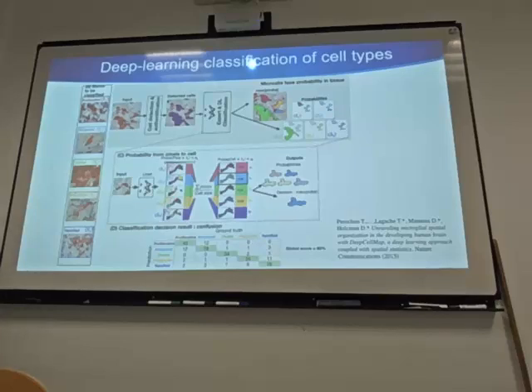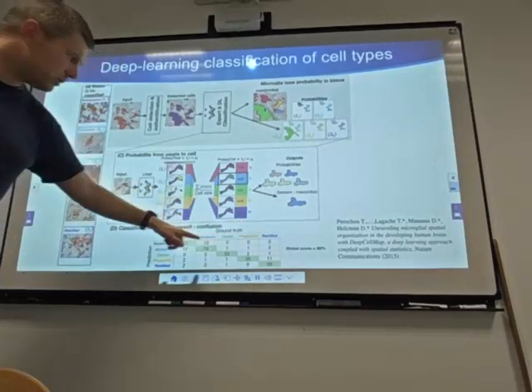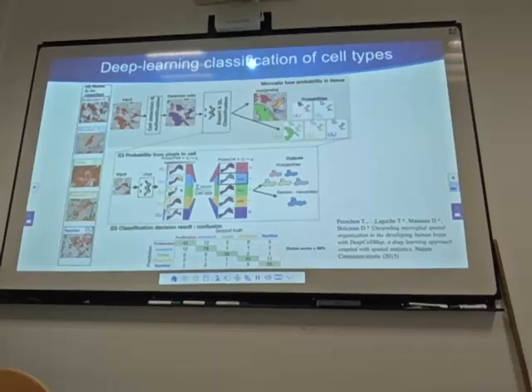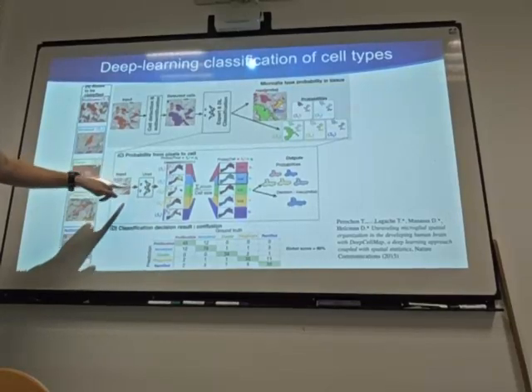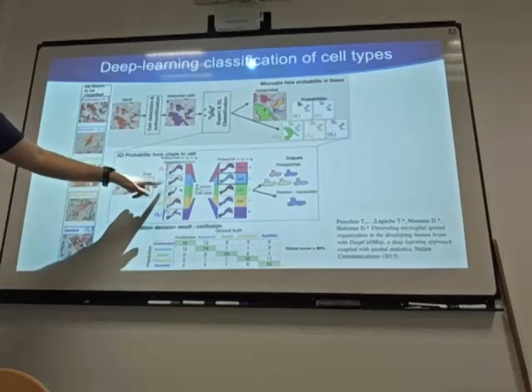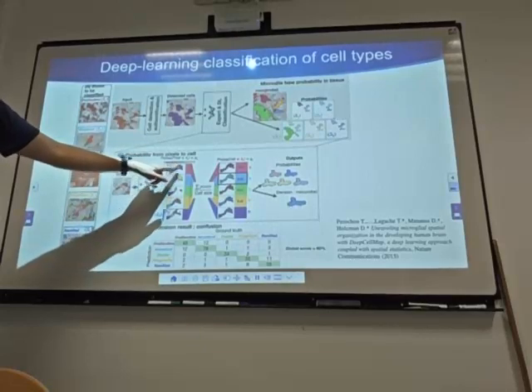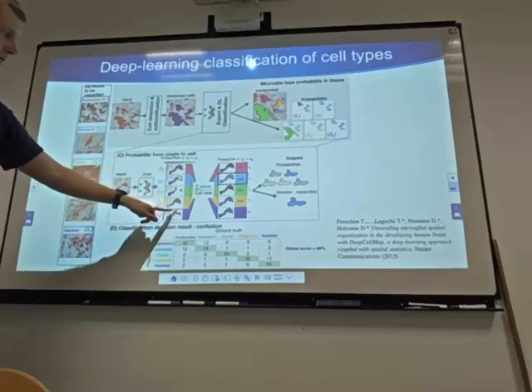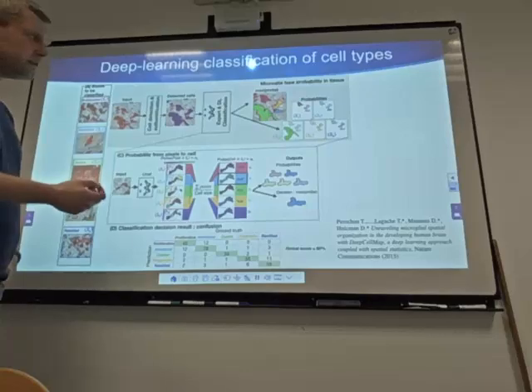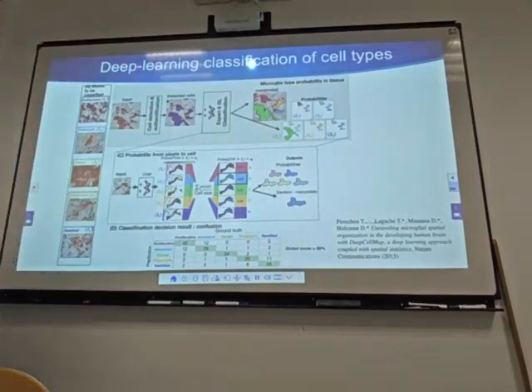So at the end, we had 5 types: proliferative, amoeboid, cluster, phagocytic, ramified, with quite a good confusion matrix. So you have this input, you train a U-Net with some manual annotation, and then it's going to give a probability for each pixel in the segmented mask to belong to one type of cell. And so at the end, you look at the total probability for one segmented structure, and you decide whether it is an amoeboid, a cluster, a phagocytic cell. And so you have a threshold.